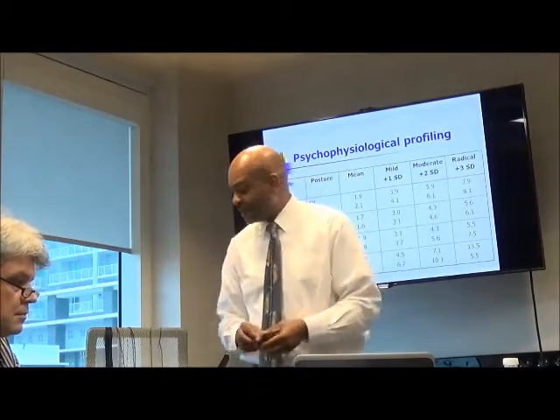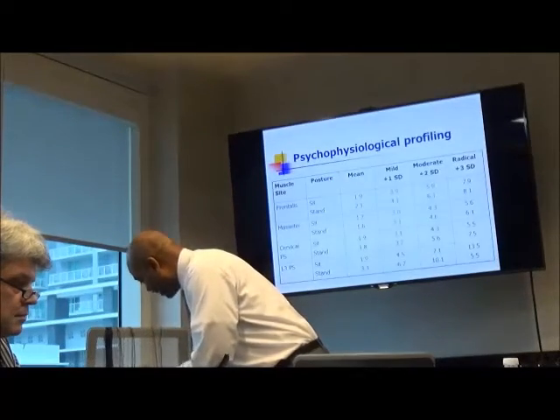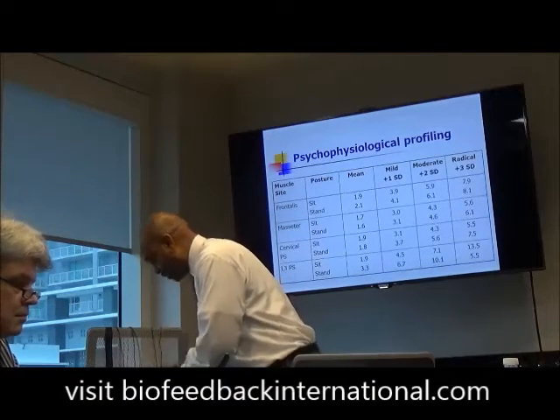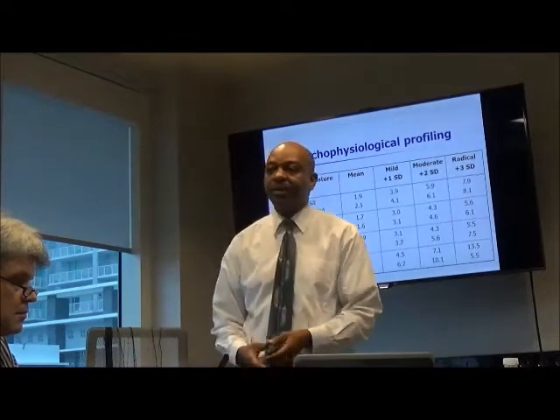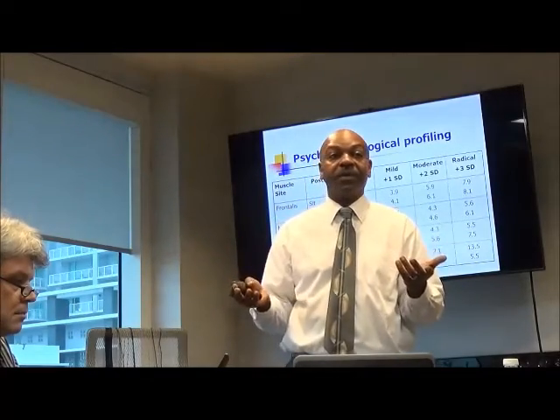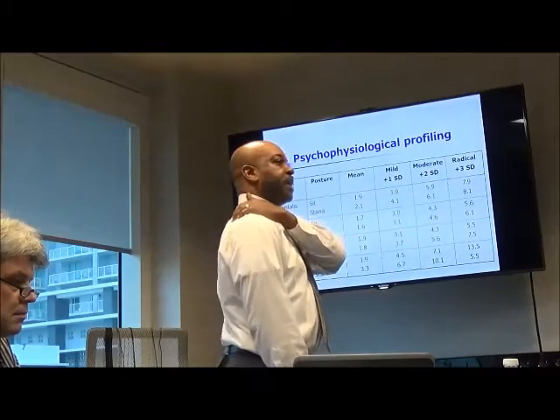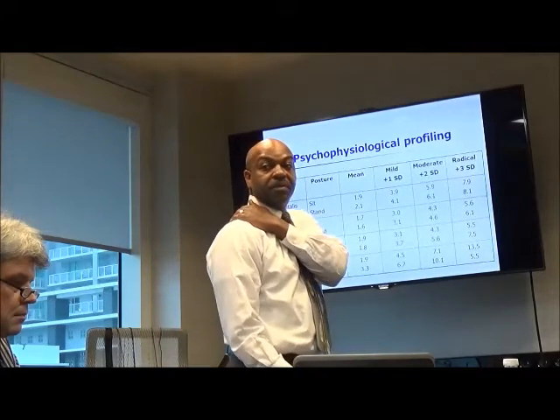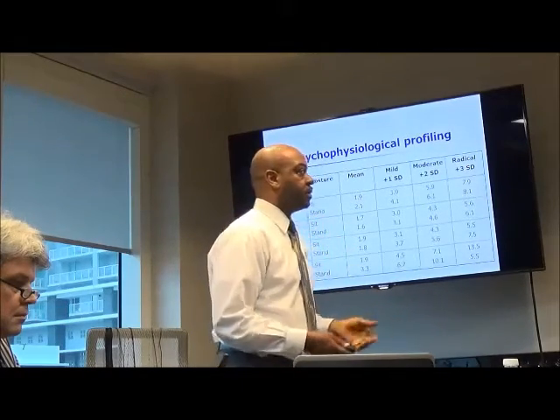So there were some possible places where you might not be getting a totally accurate reading. So there's some user error possibilities there. And yeah, if you knew how to do it properly, you could get a pretty good reading, and it would give you some idea as to where you might want to focus in doing EMG work with the person. So for instance, if I find they have 15 microvolts of muscle tension when they're supposed to be relatively relaxed, I know maybe I should do some work with the trapezius for that person to learn more relaxation.